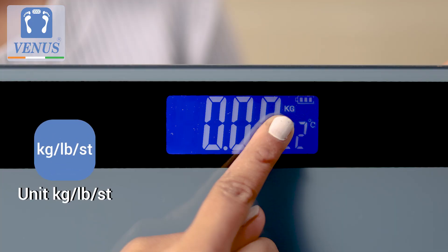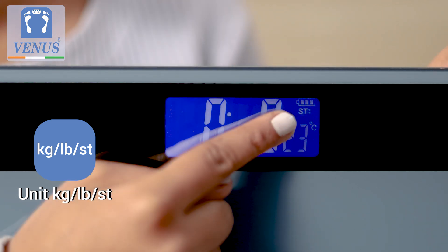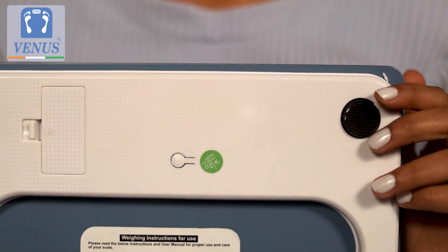The unit of measurement by default is set up to measure in kilograms and can also be adjusted to pounds or stones by simply pushing the button at the back of the scale.